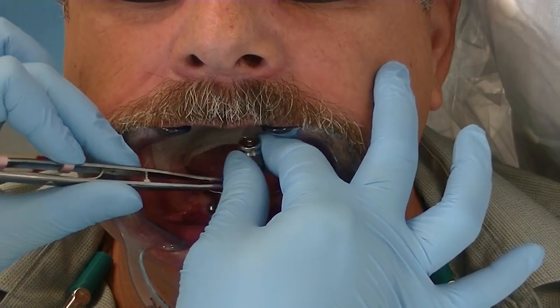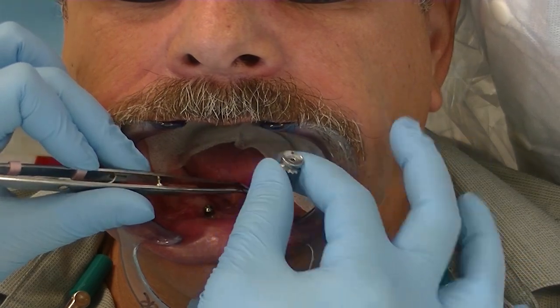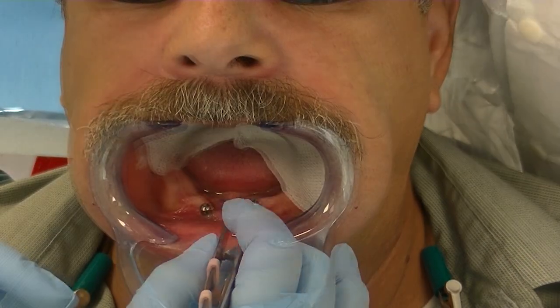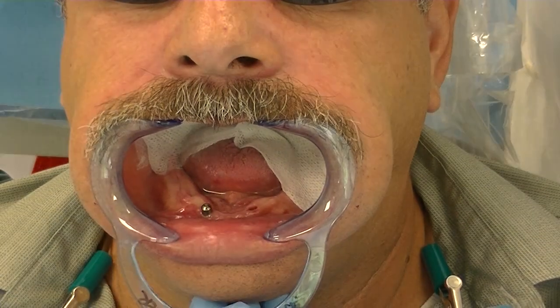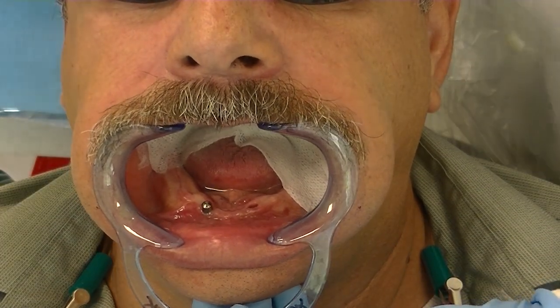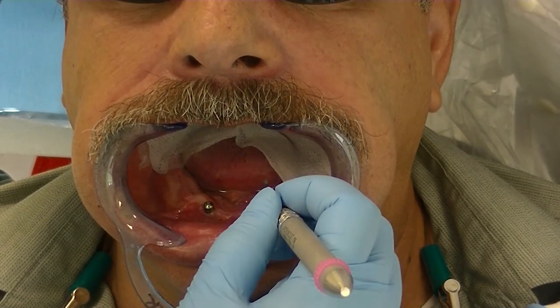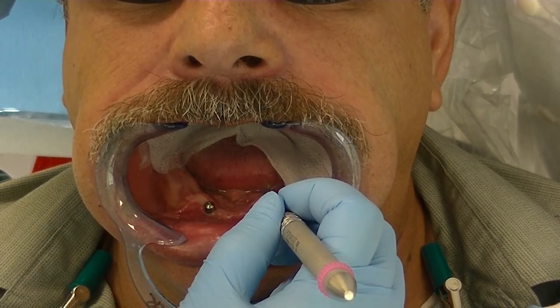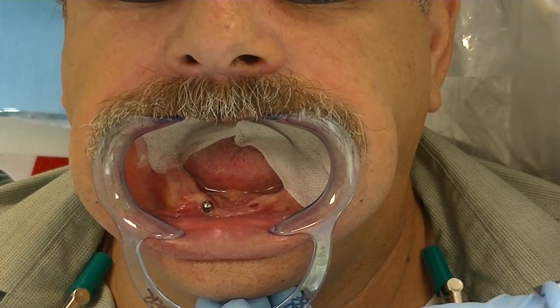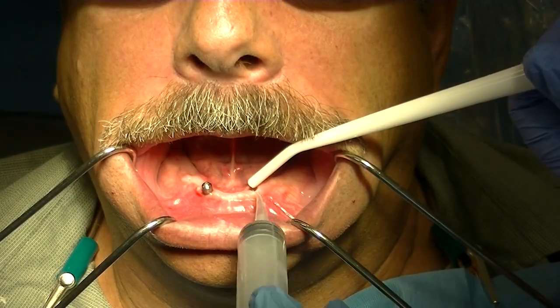We have our patient here with two dental implants. These happen to be 3i 3.25 millimeter diameter implants and we're removing his healing abutments on those implants. We're going to go ahead and measure our tissue depth for our locator attachment. This happened to be 3 millimeters for each implant, measuring from the platform of the implant to the top of the tissue.